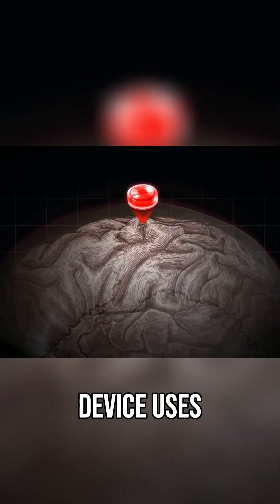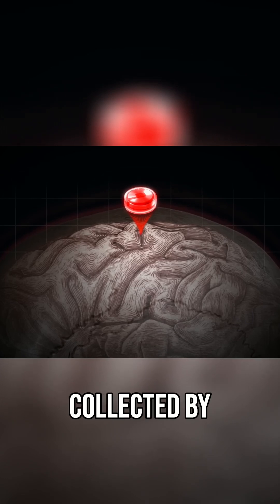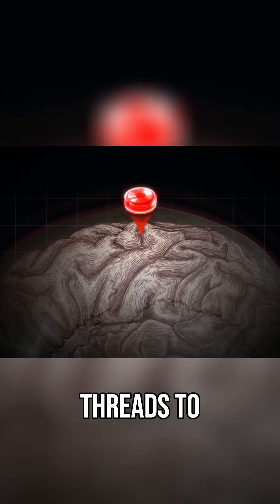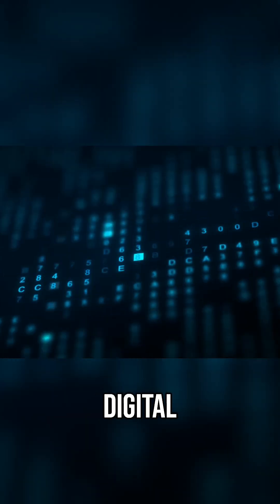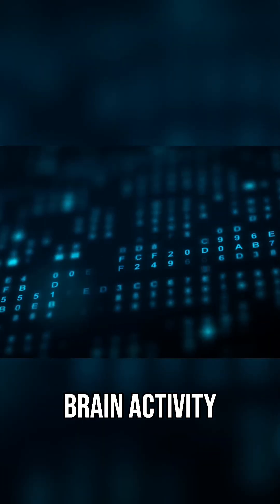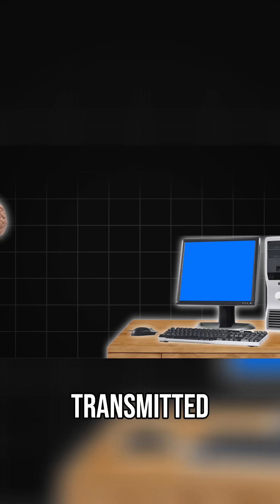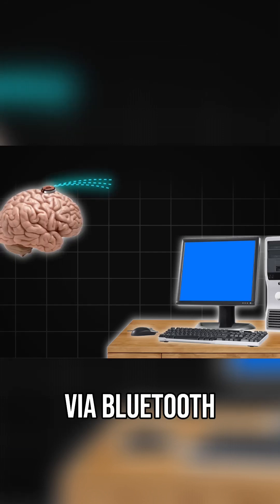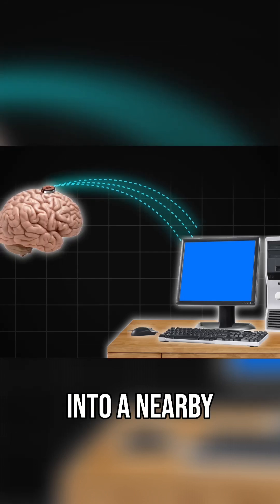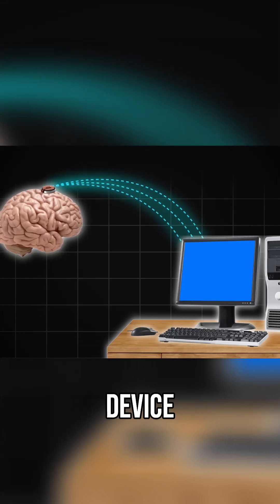The link device uses signals collected by the threads to create a digital representation of the brain activity that can be transmitted via Bluetooth into a nearby computer device.